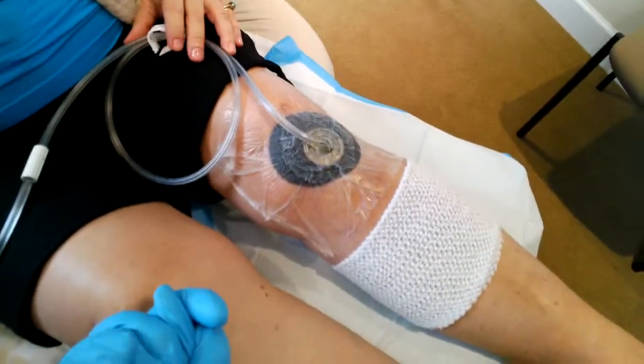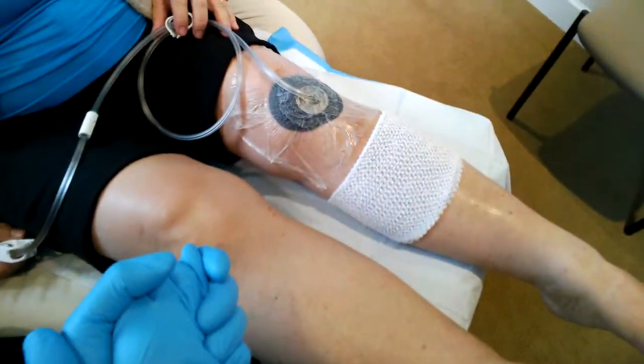So that's the KCI WoundVac. I just want to thank our patient for allowing us to film this video.